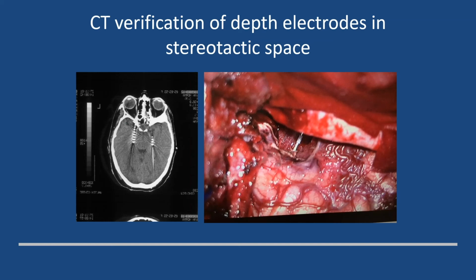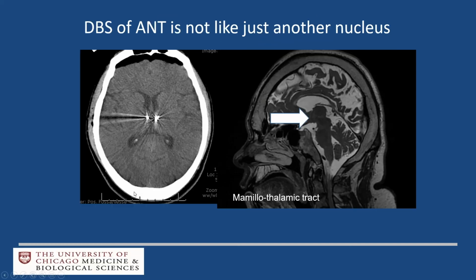So sometimes, to make life easier when you have to do either an open resection or, in this case, a selective amygdalohippocampectomy, we put the depth electrodes very close to the brainstem and the tentorium, and you can leave them in basically as a marker. So when you see your electrode under the microscope, the next thing you'll see is the tentorial edge, which is very helpful.